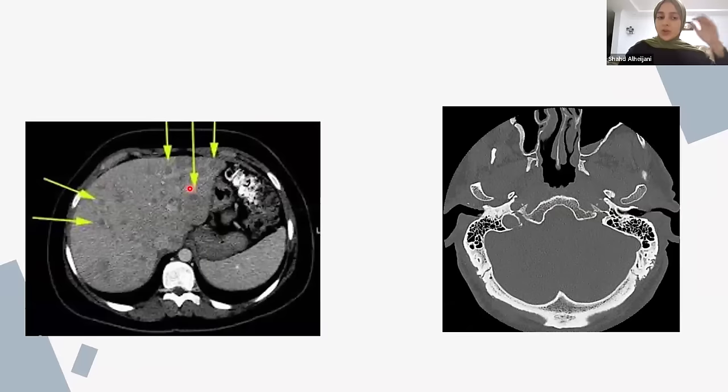Here you have the liver window. So again, attenuation focused at that for the liver. But for example, the other structures are not as clear as the liver. And finally, here you have the bone window, because you can see the bones the clearest. So any fracture in the bone will be clear. Any abnormalities in the soft tissue won't be that obvious. So this is the bone window.